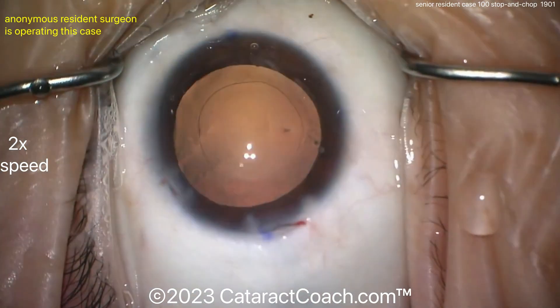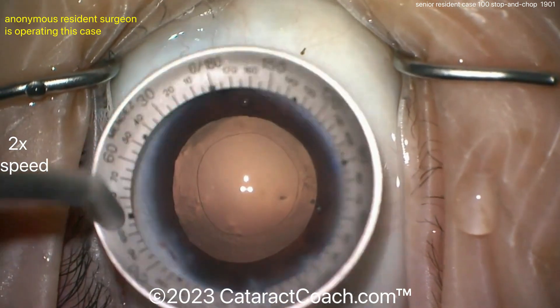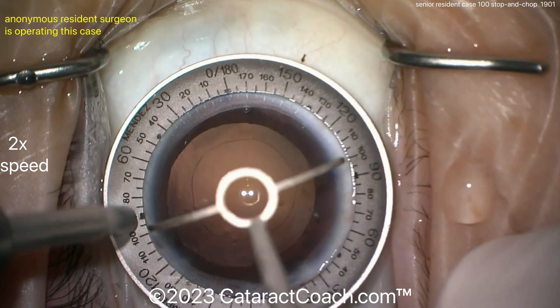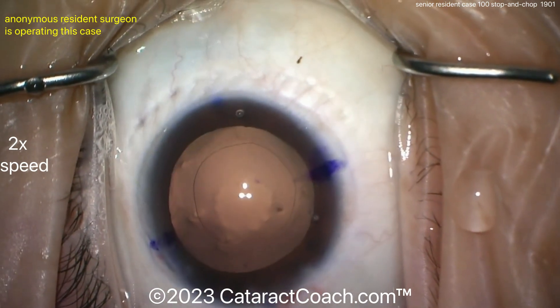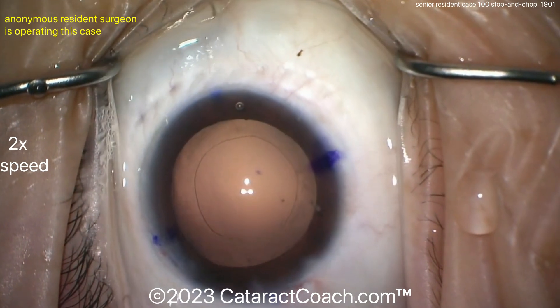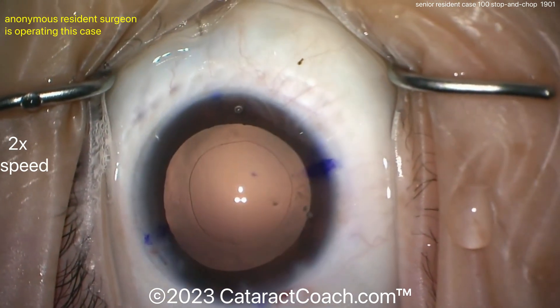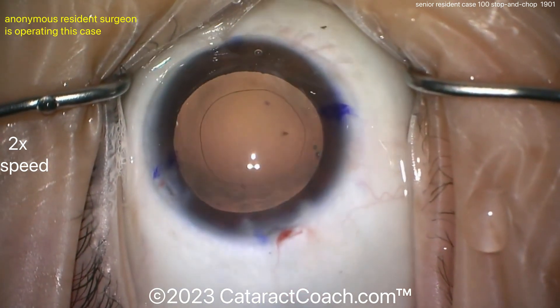It looks like drying off — is this going to be a toric lens? Here comes a Mendez gauge or something similar, lining it up with the 180. Now placing some marks — this patient looks like they have with-the-rule astigmatism and will be getting a toric lens. Very nicely done. In this case, be careful with that incision you made — it's a little on the short side and may cause a little more astigmatic flattening than you're expecting.